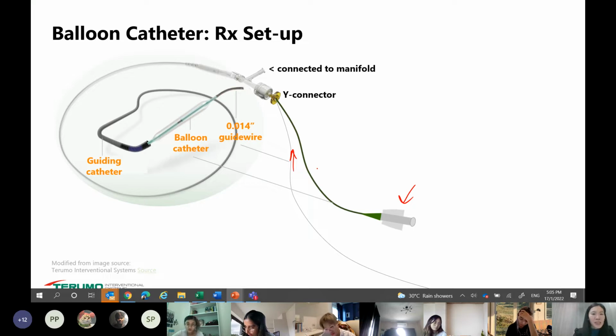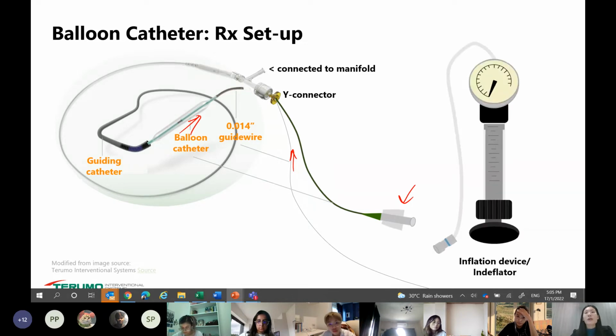And when this treatment catheter goes through the guiding catheter, the balloon catheter may come out of your guiding catheter, as it's a treatment catheter, right? So your balloon catheter will be extending from your guiding catheter. Again, this is a bit hard to visualize like that, but once you see the actual vessel model, you'll be able to appreciate it more.